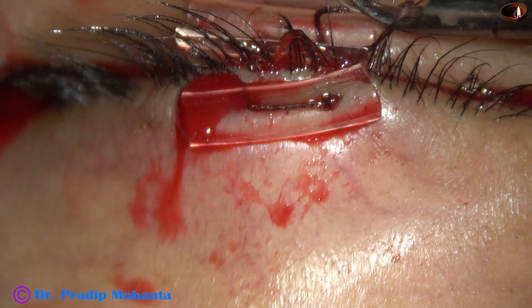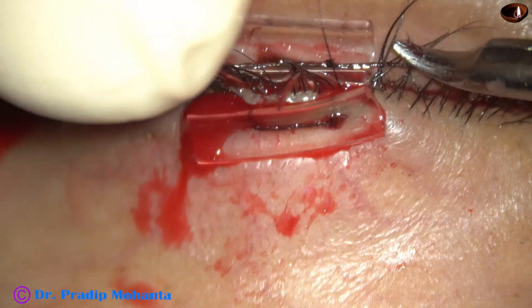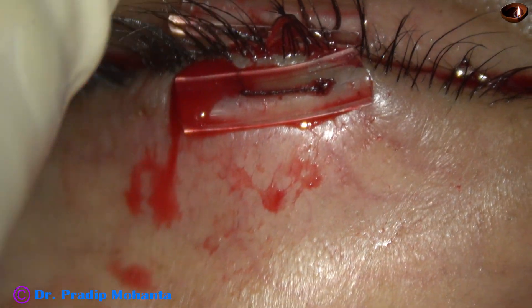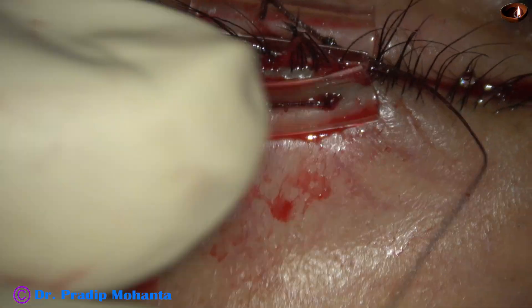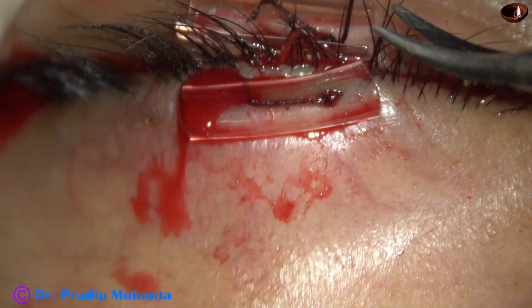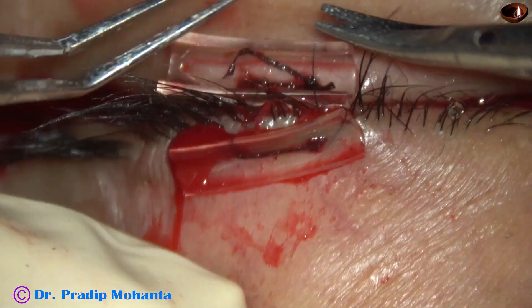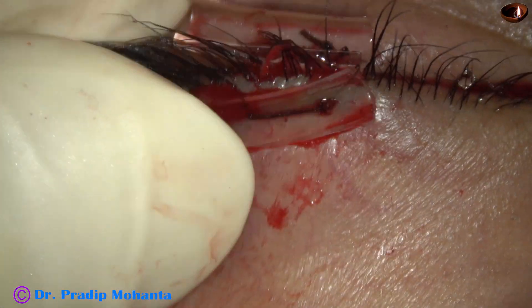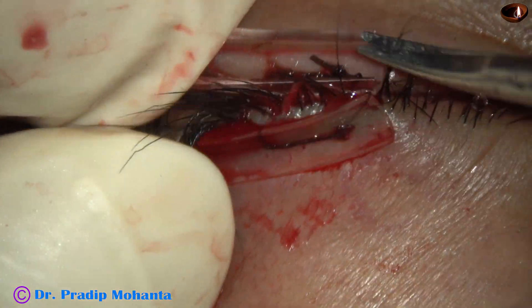Now I pull it very carefully — firmly but not very hard so that it does not tear off. I put two throws, then one throw, and pull firmly but not very hard, then one more throw. This is a 2-1-1 suture, and now I cut the threads. The lid margins are nicely opposed and we are expecting a very good result.